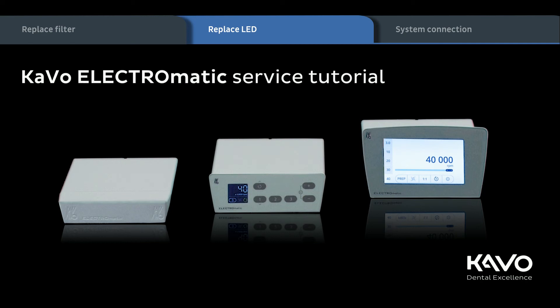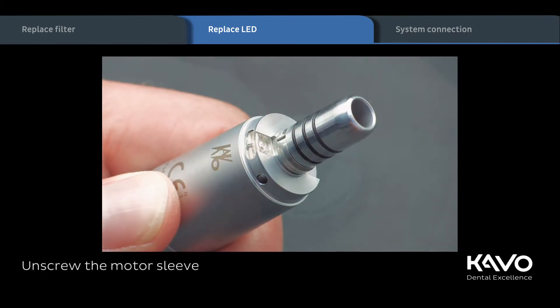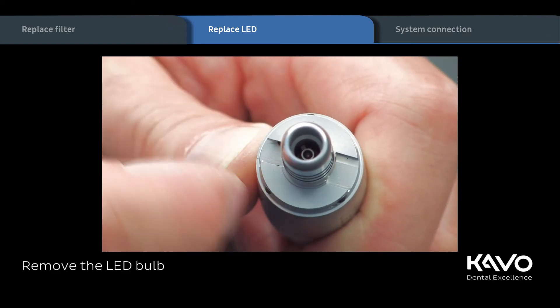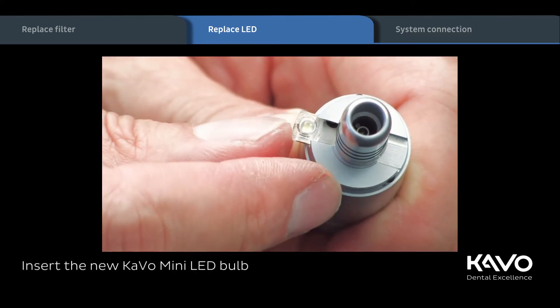Now let's take a look at the replacement of the LED lamp. First of all, pull off the motor sleeve while twisting slightly. Then remove the defect LED lamp and insert the new Kavo Mini LED lamp into the recess so that the Kavo logo stays visible.